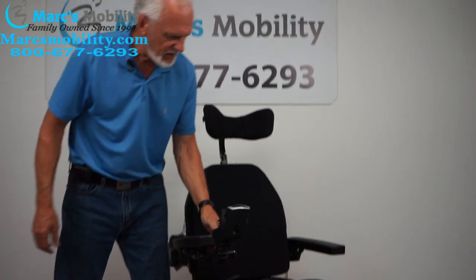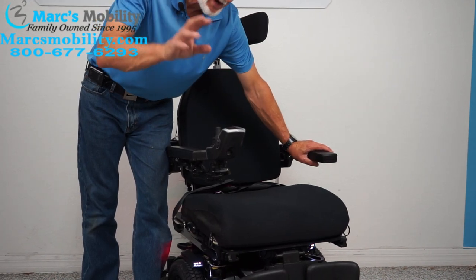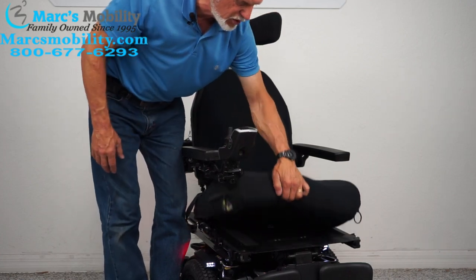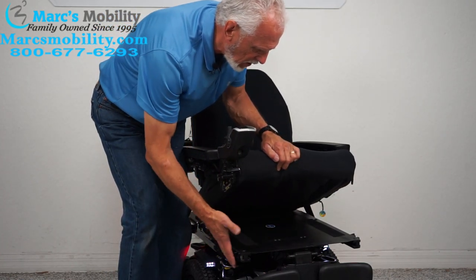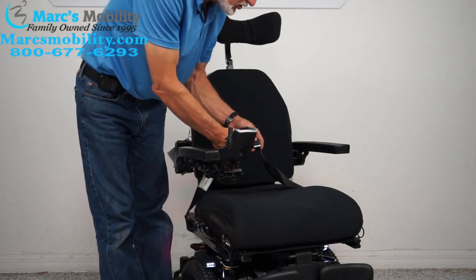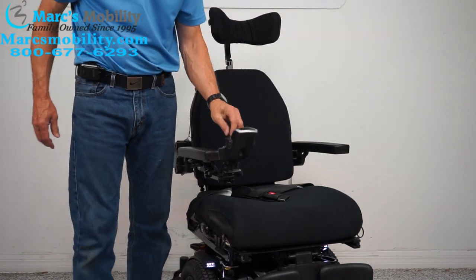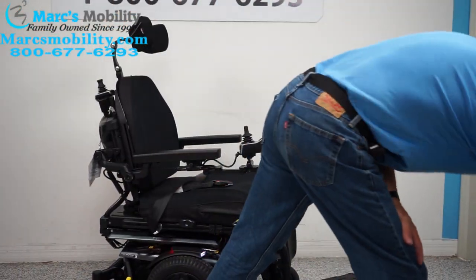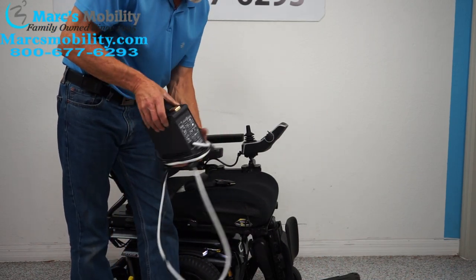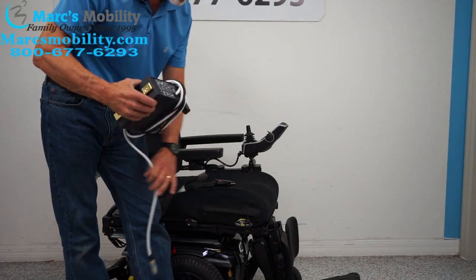The seat on this chair is 20 by 20 roughly, but we can size up these chairs according to your height and weight. If it's too big, we can take the cushion off and make the seat pan smaller. We can change the back cushion — we can size them up for you at no extra charge. There's also a safety belt and a flip-up arm. When you charge your chair, plug in your Quantum charger and as soon as the light goes from orange to green, the charger stops — these are smart chargers that will not overcharge your chair.